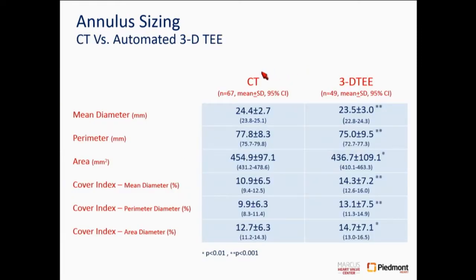So here is the data. These are patients who had CT and 3D TEE. This is 3D TEE only. And if you look at this, these are patients who have had CT and 3D TEE, I beg your pardon, in the same patient.